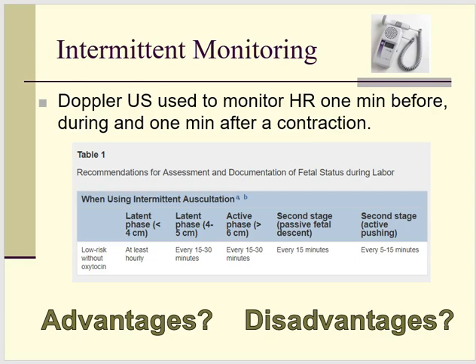There is a type of monitoring called intermittent monitoring I'm going to briefly mention in case you might see it in clinical. Different facilities use this more often than others. You're less likely to see it at Banner Gateway, for example, than you are at Mercy Gilbert. It just depends on the culture of the facility you're going to.